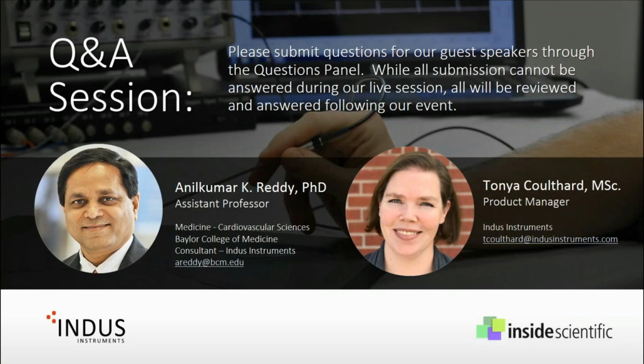Okay, perfect. Thanks both of you for that answer. And this might lead into the next question, and perhaps you've already answered it. Jose has asked if it's possible to use frequencies less than 10 and 20 megahertz, and you've mentioned a couple times, Anil, that the paper is using the Doppler flow velocity system with 10 and 20 megahertz probes and how they're programmed for 1 centimeter of depth. But why is it that you chose those frequencies? What are the implications of using a lower frequency? Can you maybe talk a little bit about that?